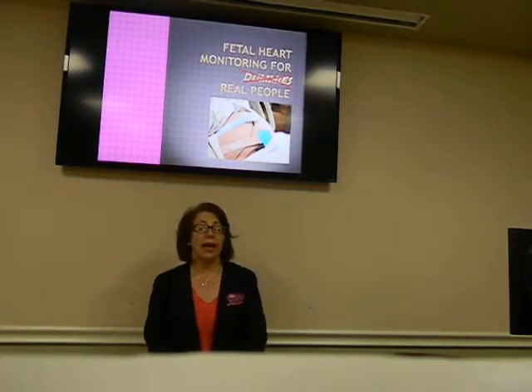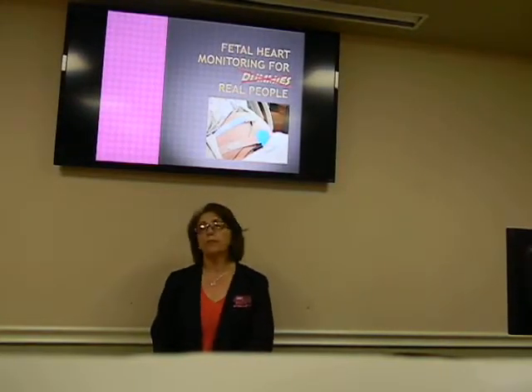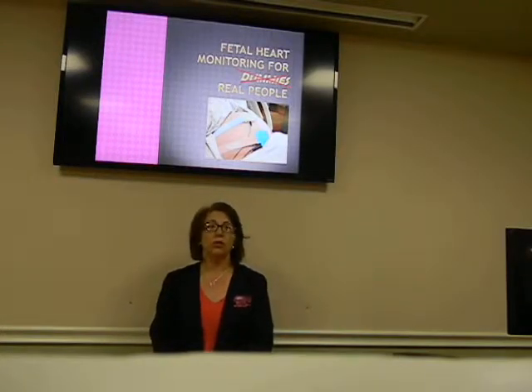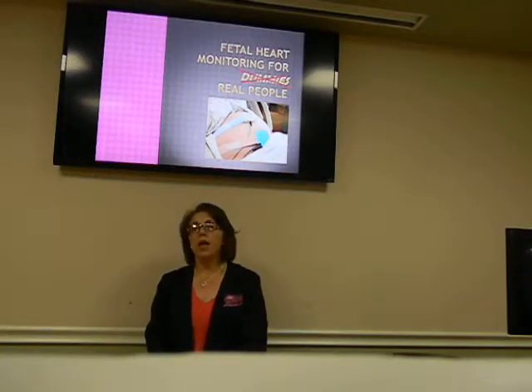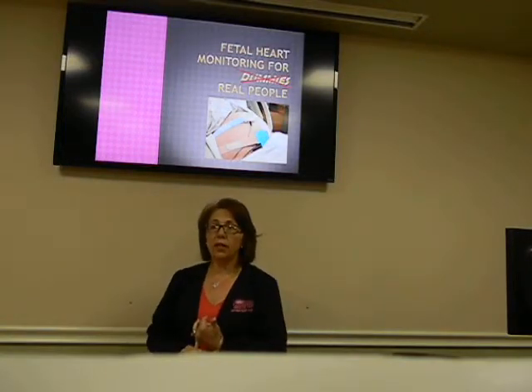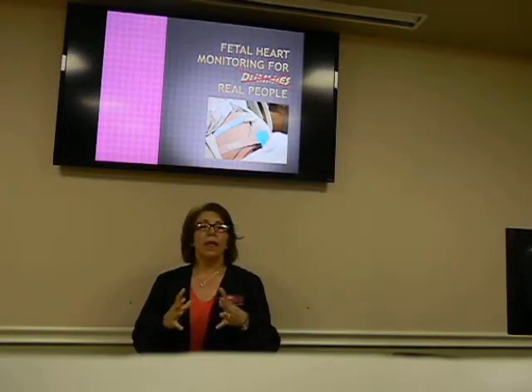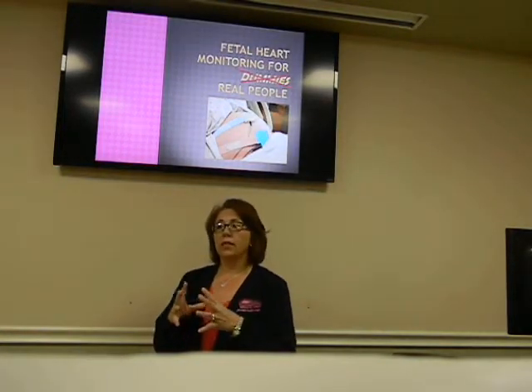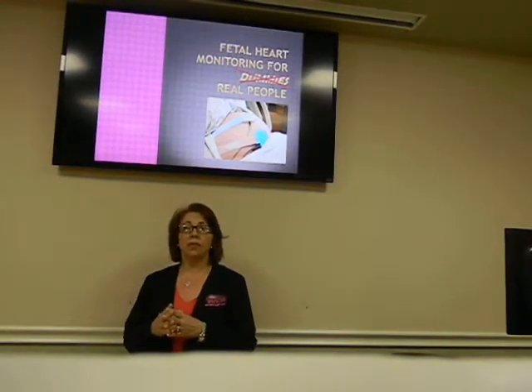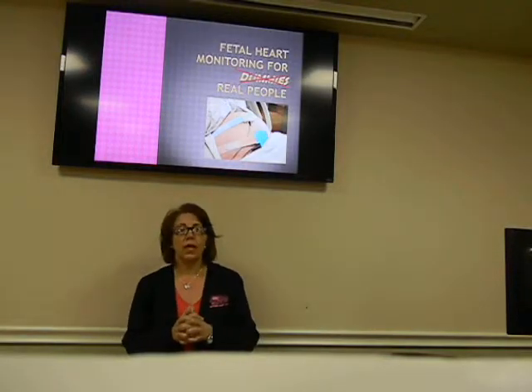Now notice that I say real people as opposed to unreal people. That would be healthcare professionals such as doctors, nurses, and midwives. So what I want to talk to you about today is the tracing, which is a piece of paper that prints out from the fetal monitor, and healthy signs of a baby and babies that could possibly be in trouble. So let's talk about the tracing a little bit.